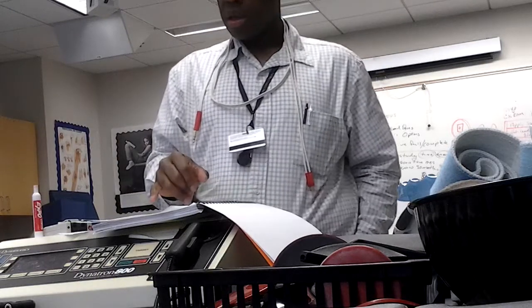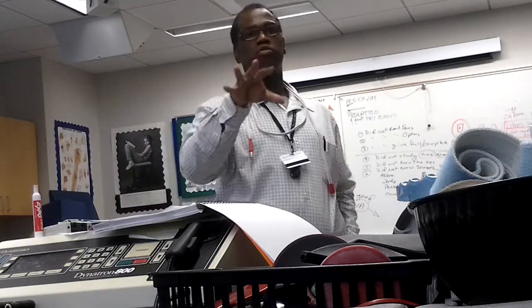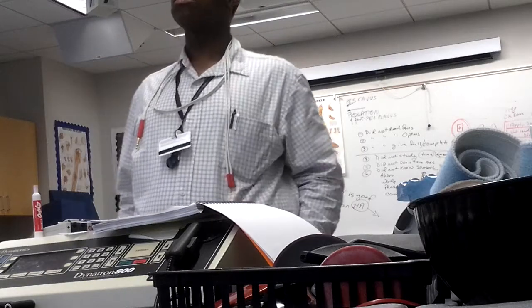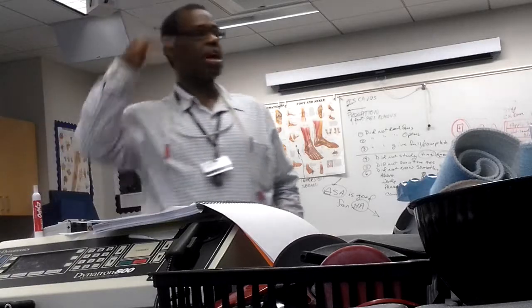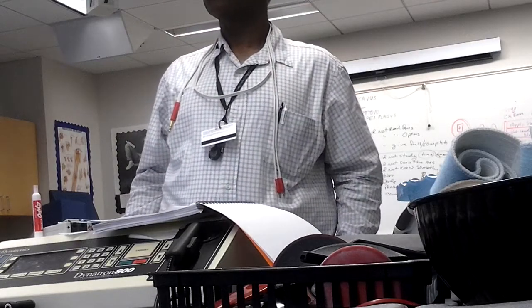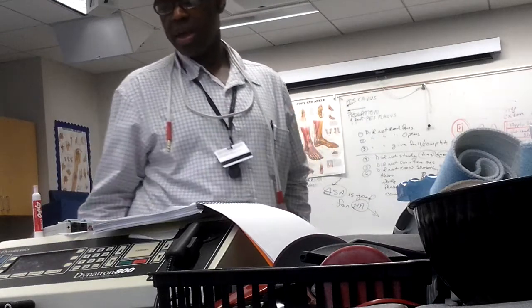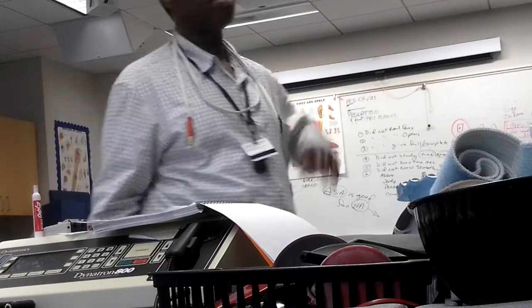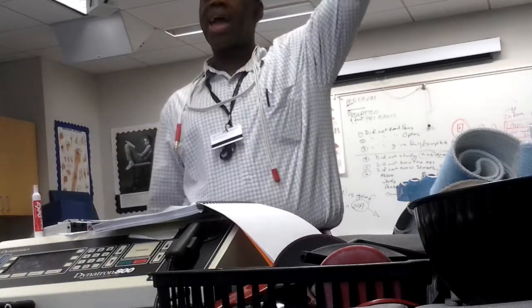All right. Some middle numbers for pulse rate might fall where? 50 up to 70. Good. 50 up to 70. And I can treat what with that? Muscle re-education. Good. I can do that. Okay. And then, what's high? What's considered high? 80 to 100.